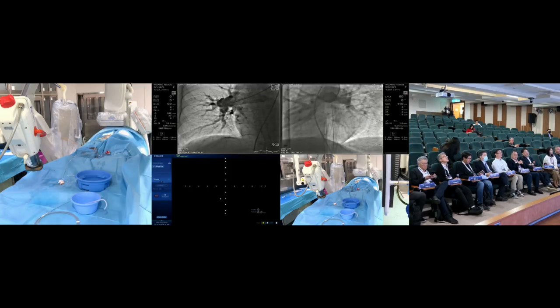We will finish the angiography, and later we will do the selective pulmonary angiography to decide which lesion to target. From the lung perfusion scan, there is a large perfusion defect at the right upper lobe and several small perfusion defects in the right lower lung area.